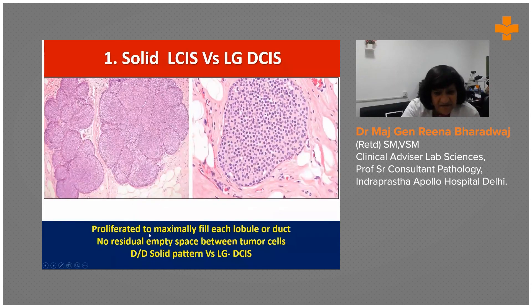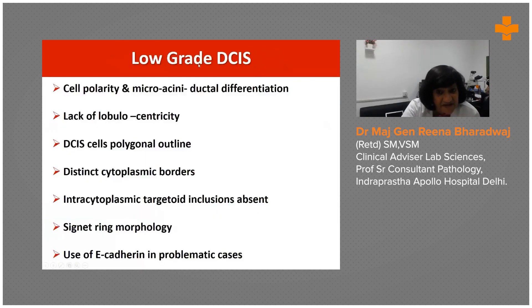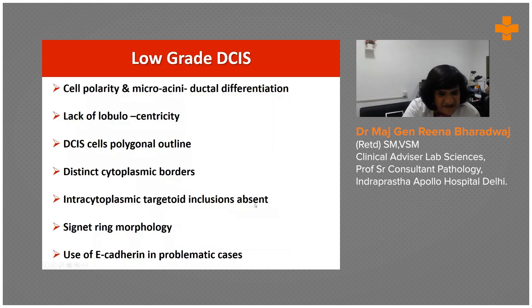The whole lobule is expanded, which will not happen in DCIS. In DCIS the cells tend to be more polygonal with distinct cytoplasmic borders. Those intracytoplasmic targetoid inclusions will be absent in DCIS. You will not have what is called a signet ring morphology, as we'll discuss later.